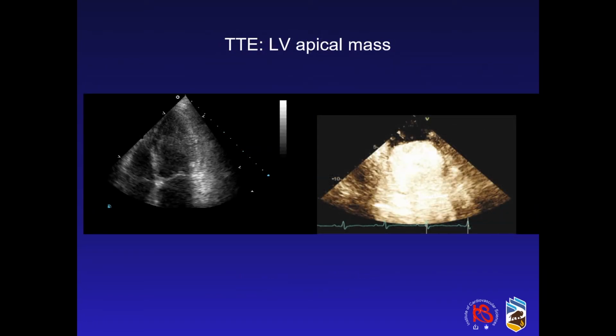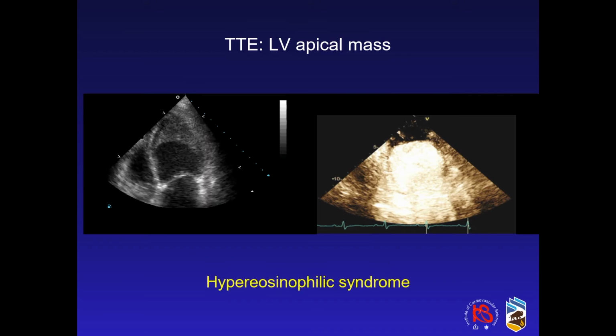On these echocardiographic images without and with contrast, this is an individual who presents with myalgias and was found to have evidence of increased eosinophilic count on their blood work, consistent with hypereosinophilic syndrome.